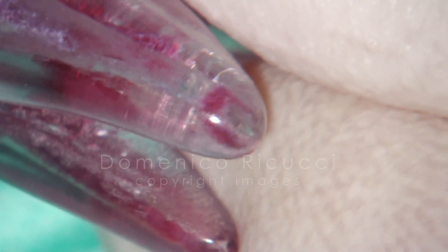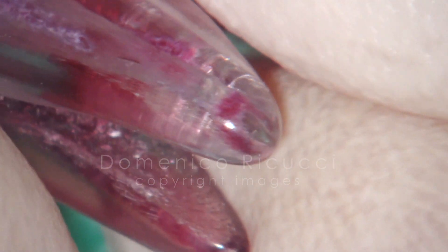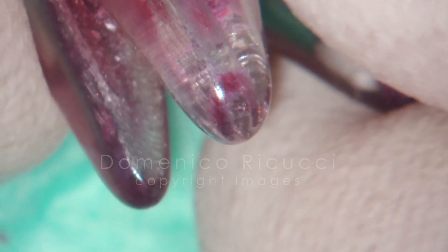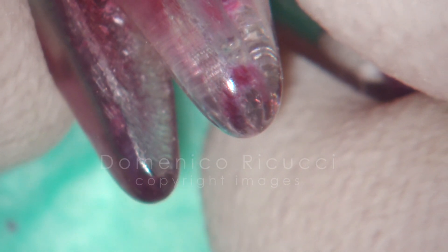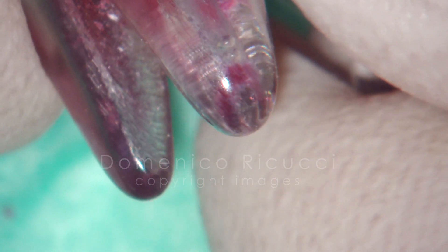Final preparation of the apical collar. Note that the tissue in apical ramifications is undisturbed.